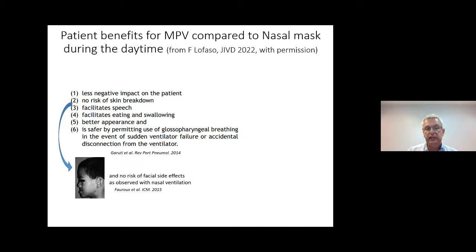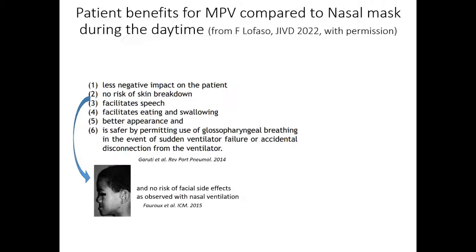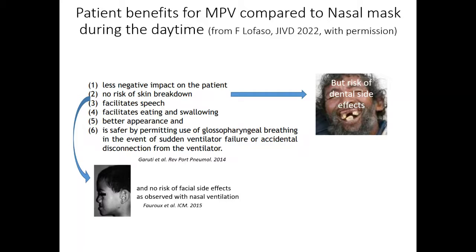It facilitates eating and swallowing. Patients report a better appearance. And they also see it as safer by permitting the use of glossopharyngeal breathing in the event of sudden ventilator failure. But there can be a risk of dental deformities. This is a risk we sometimes see in our patients.